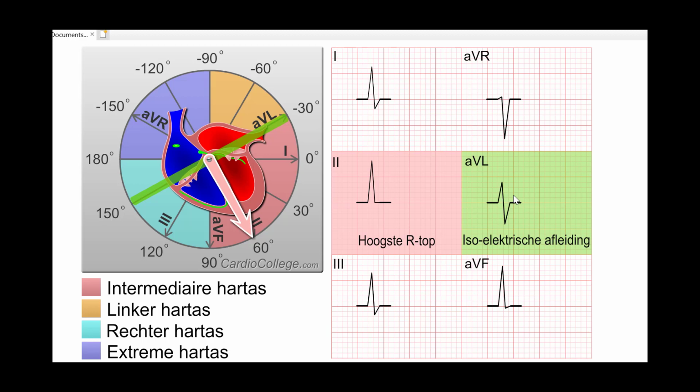Well, if you can find an equiphasic limb lead, it means that the heart's electrical activity is moving perpendicular to AVL, which would be either lead 2 at 60 degrees or above AVR at a minus 120 degrees. Well, we can't be moving up towards AVR because that signal is negative, inverted. So we must be moving, as we already know, down towards lead 2. So these two signals, lead 2 and AVL, suggest that our patient's heart is depolarizing at 60 degrees, and we would report their axis at 60 degrees, down and to the left.